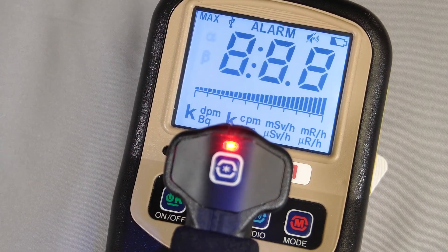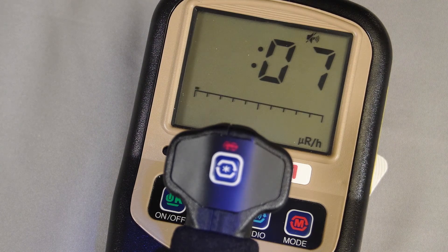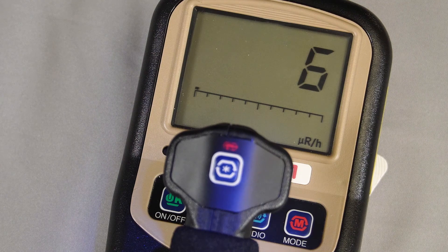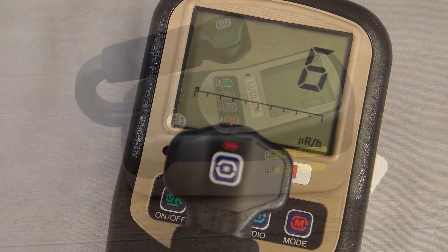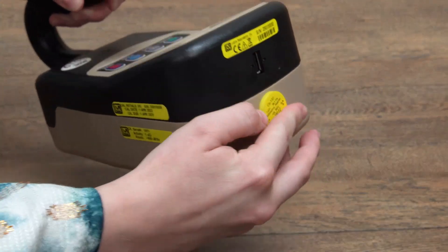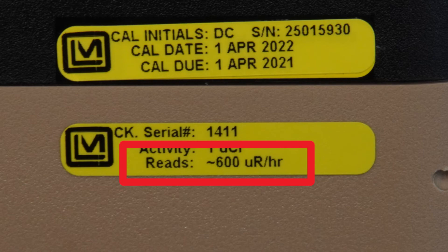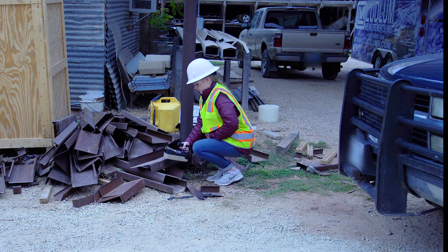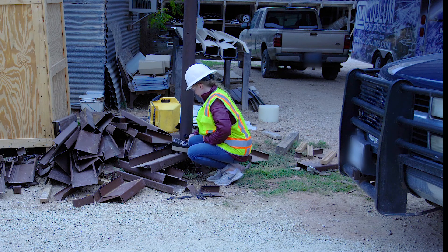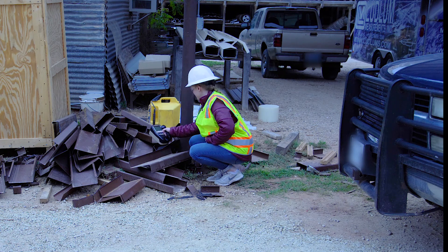Turn the meter on and wait for it to go through the boot up process. If you have a check source, perform a check source test. Make sure the meter reads within 20% of the reference reading recorded on the side of the instrument. Perform a survey by placing the meter as close as possible to the material and move slowly. Listen for audible and visual indications of readings above the local background levels.